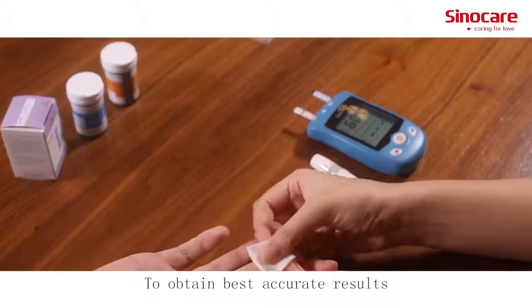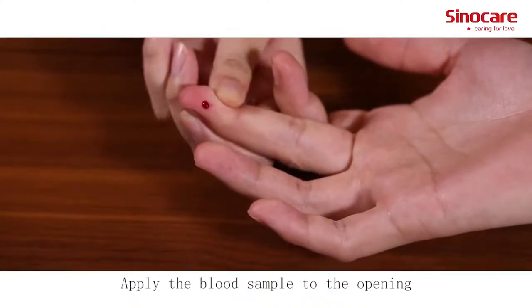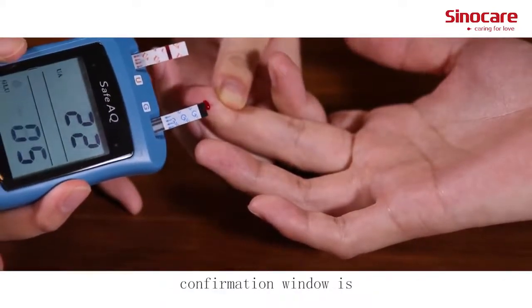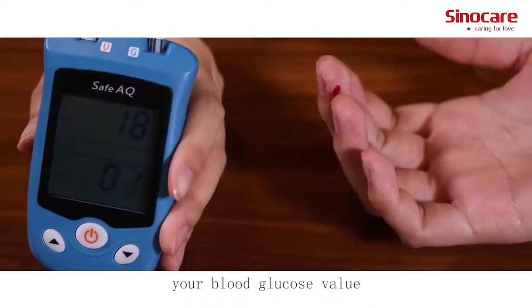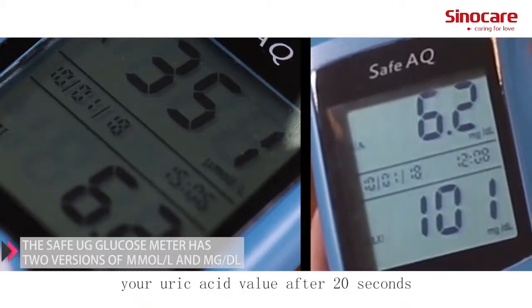To obtain the best accurate results, wipe off the first drop of blood and squeeze another. Apply the blood sample to the opening of the absorbent channel of the test strip until the confirmation window is fully covered with blood. The meter will display your blood glucose value after 5 seconds and your uric acid value after 20 seconds.